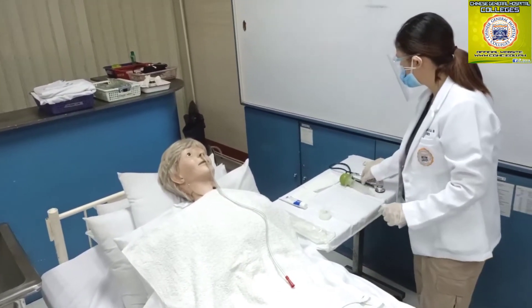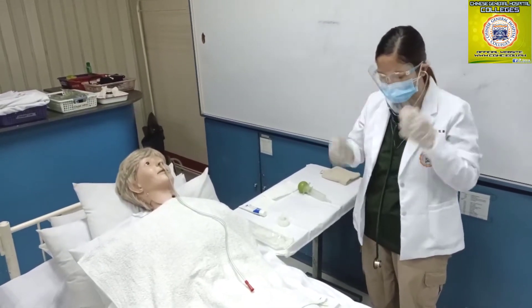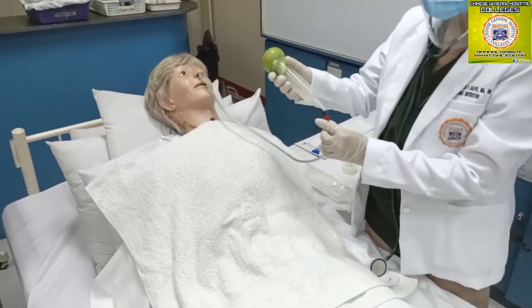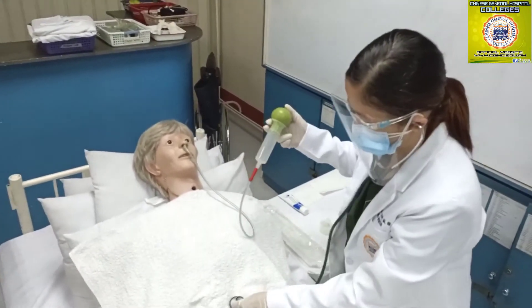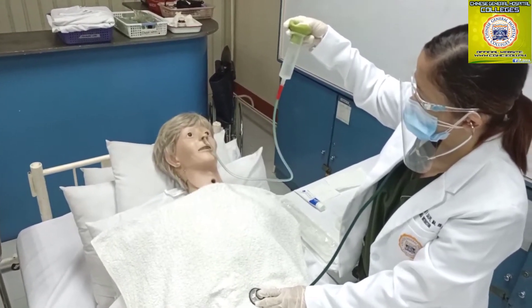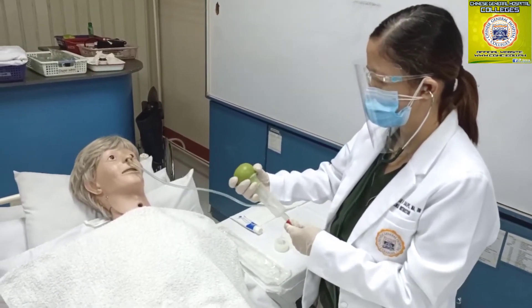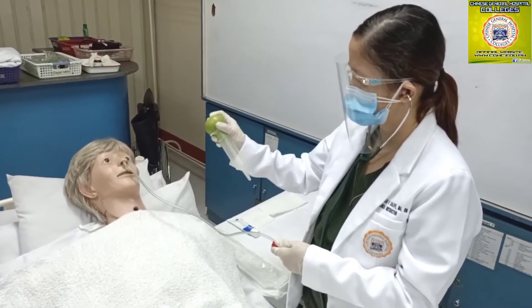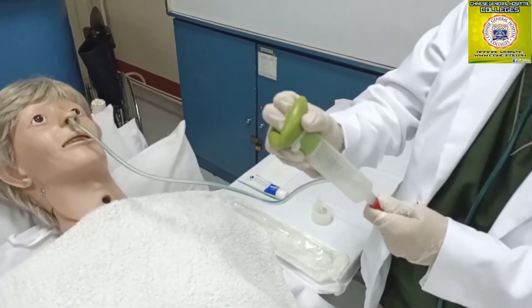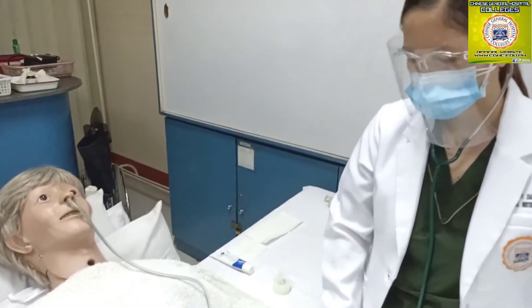Once the tube is positioned in the stomach, gently introduce a little air into the tube using the ball or piston syringe. Listen for a gurgling sound with the stethoscope on the epigastric area. Aspirate 10 ml of stomach contents by applying negative pressure using the syringe and measure the pH of the aspirated fluid. Then wash your hands.